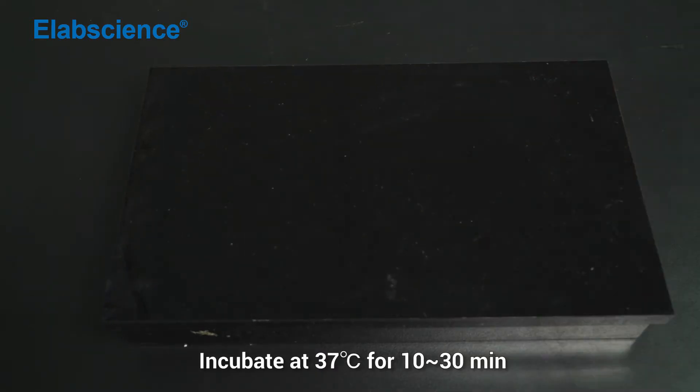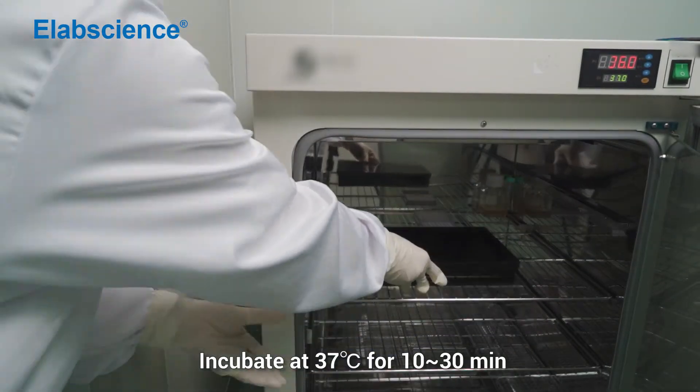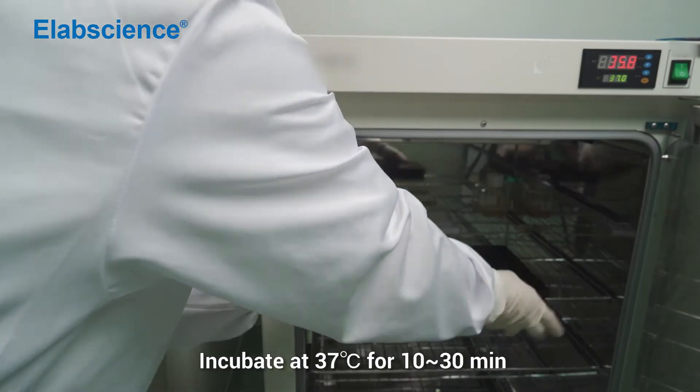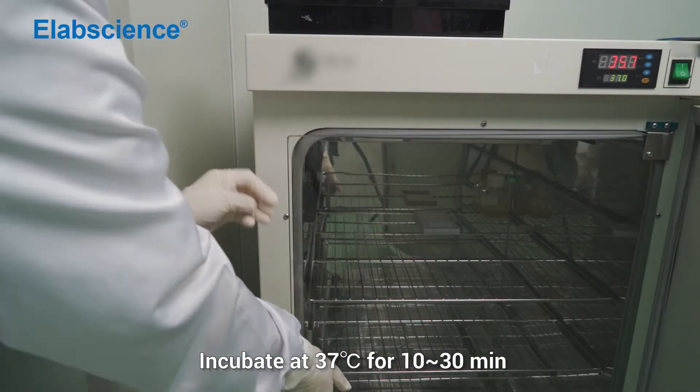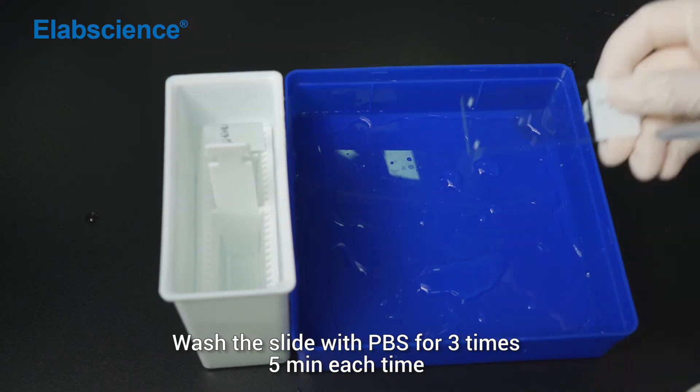Incubate at 37 degrees for 10 to 30 minutes. Wash the slide with PBS for 3 times.